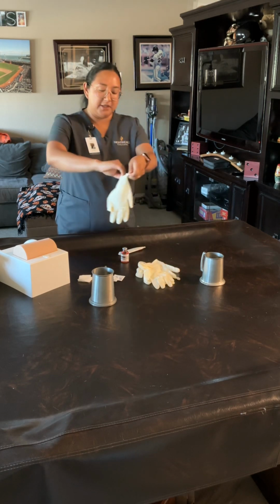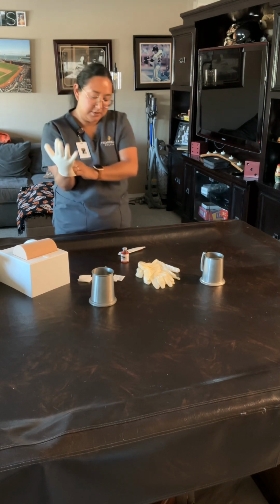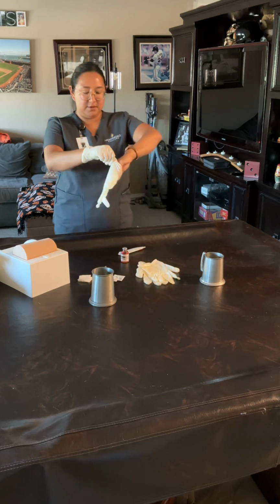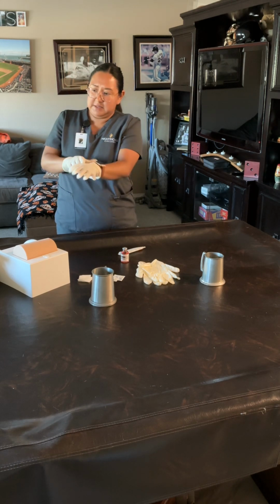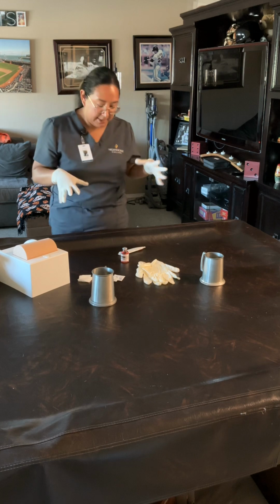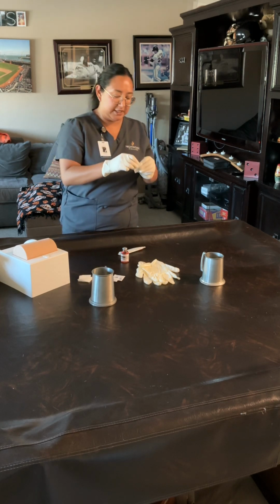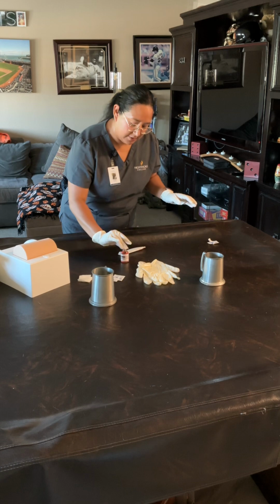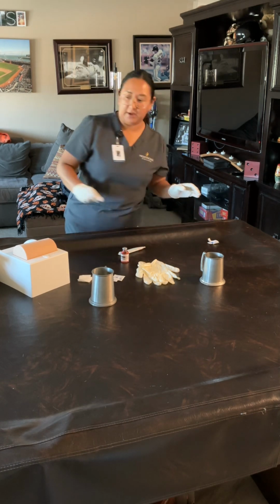Go ahead and put my gloves on here. Okay, great. Okay, so next I'll get my alcohol pad here and just clean the top of the medication here, throw that away.